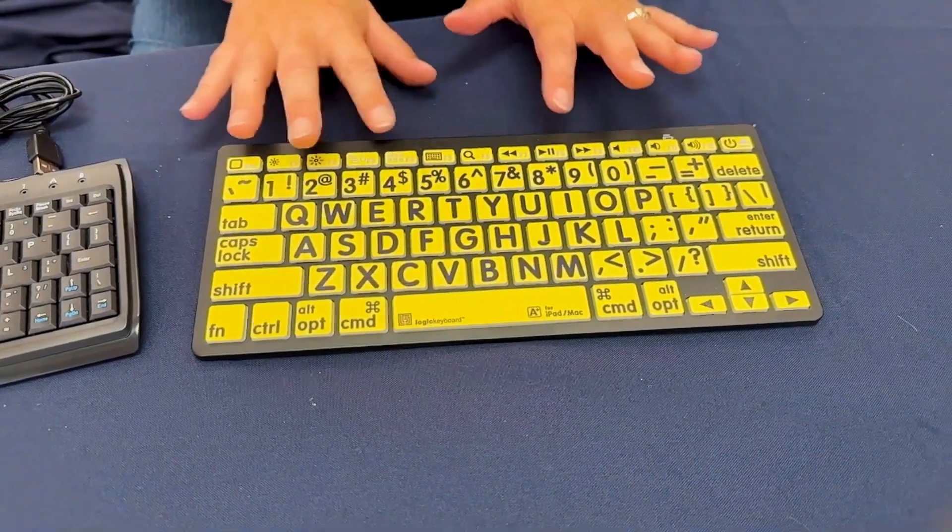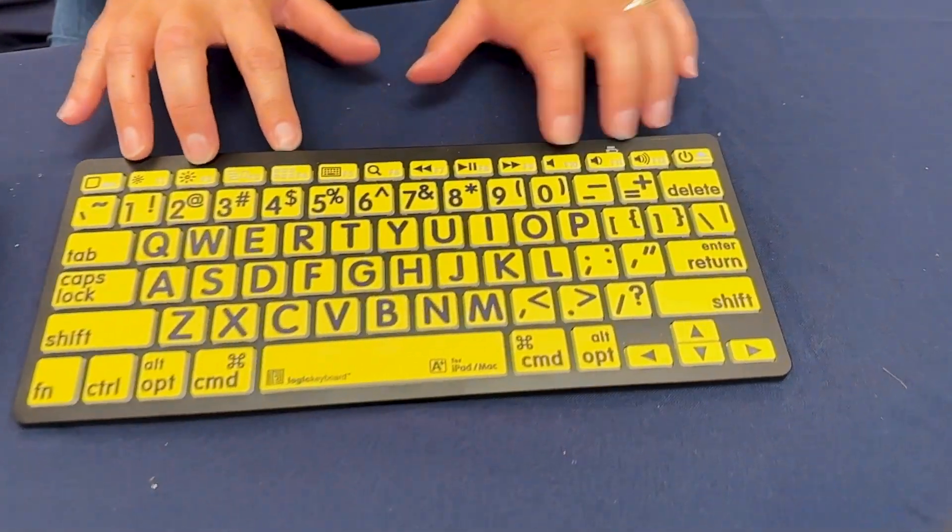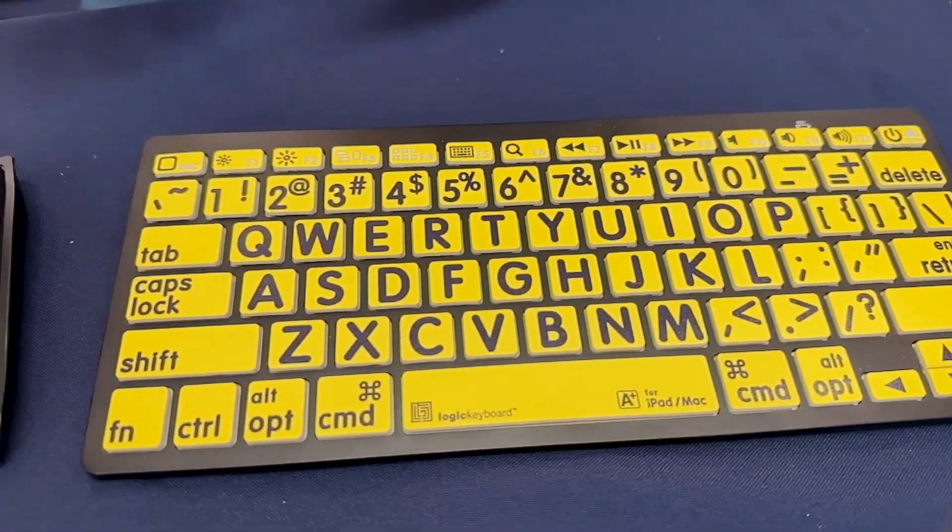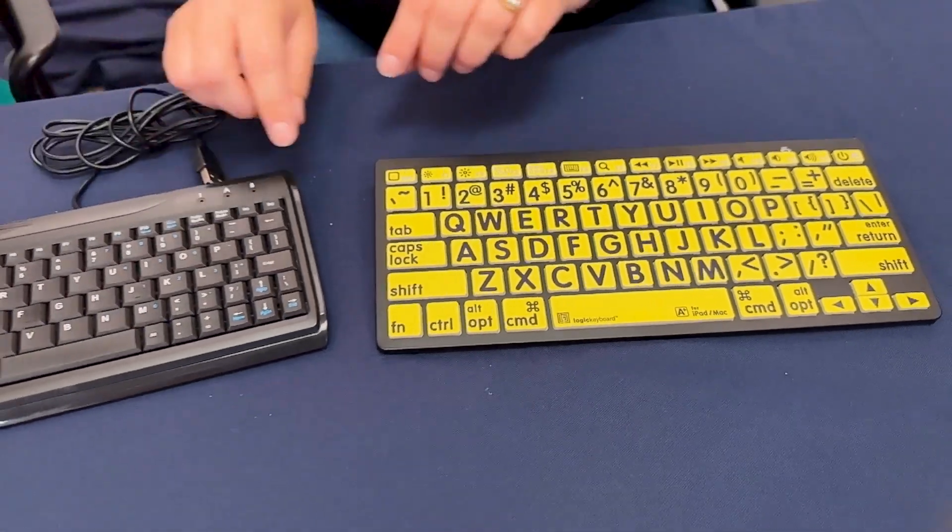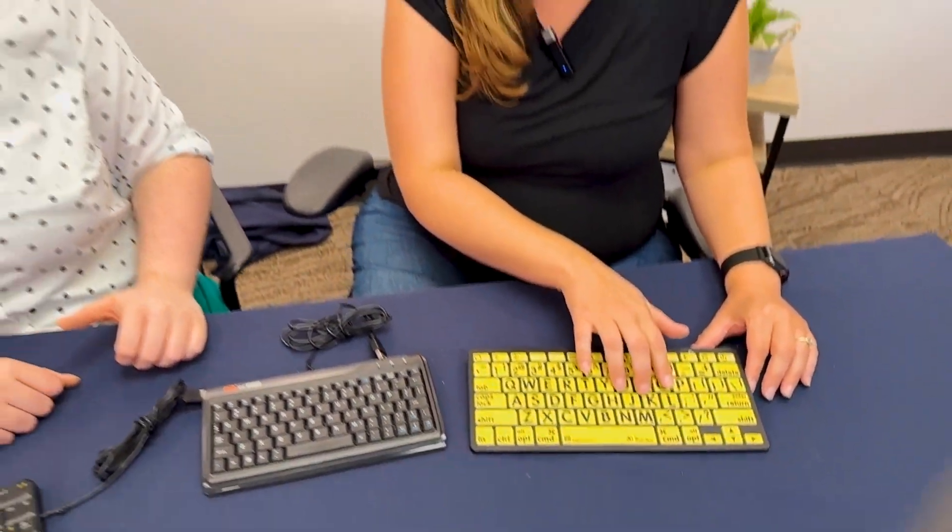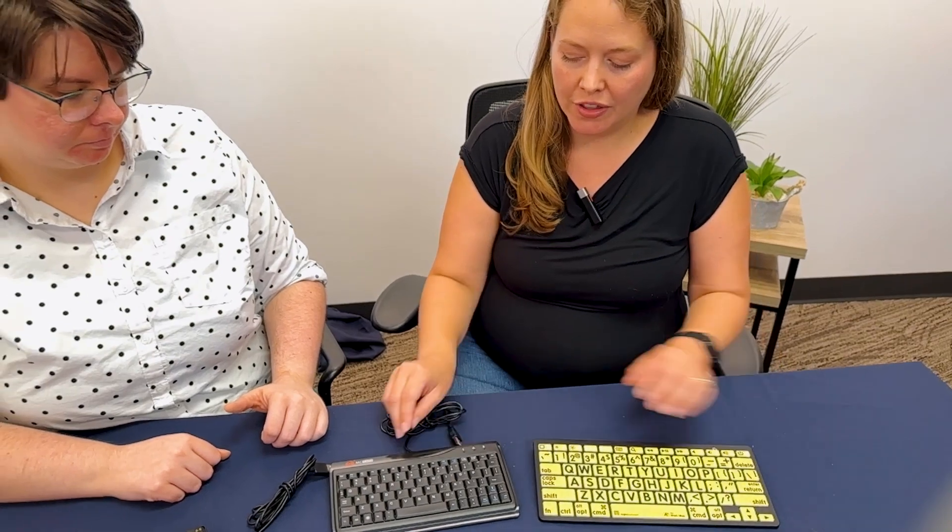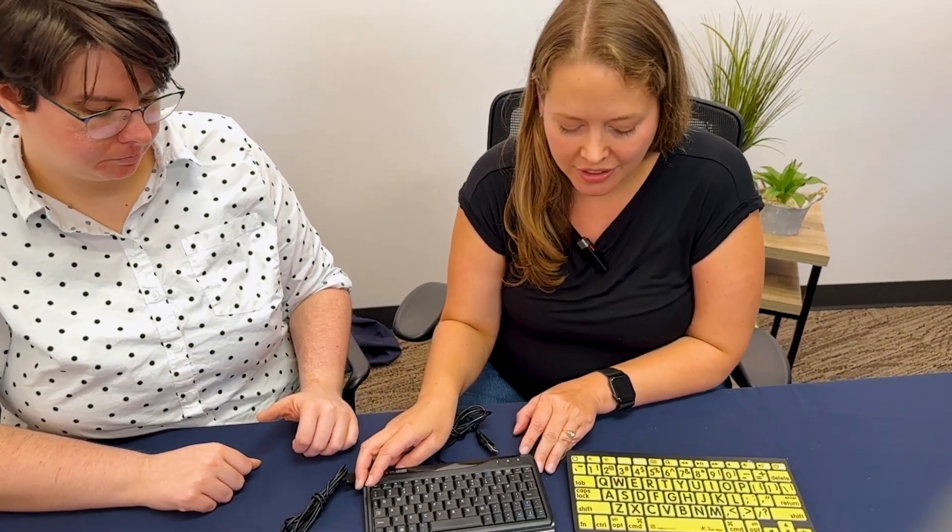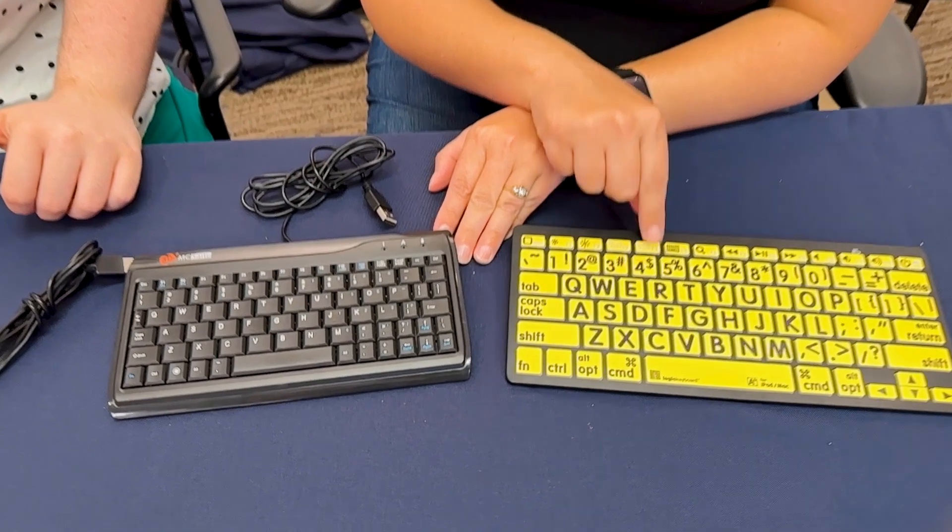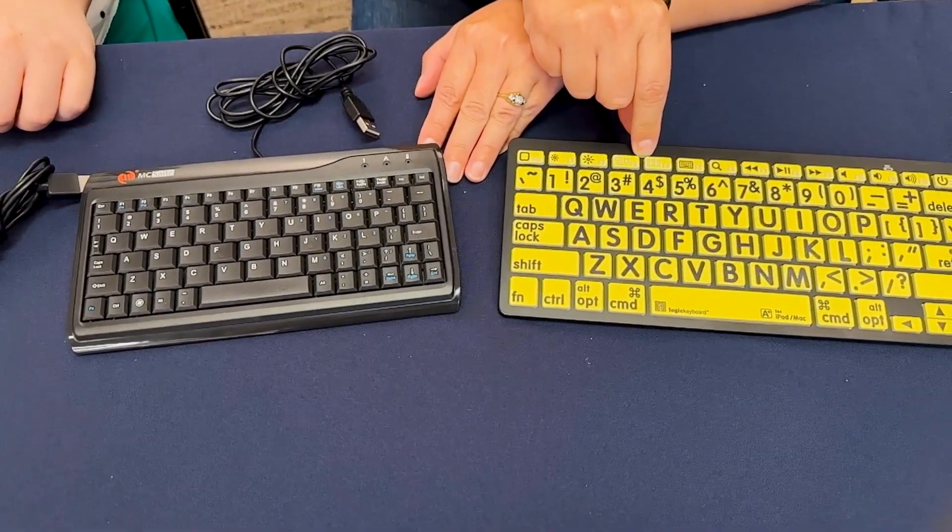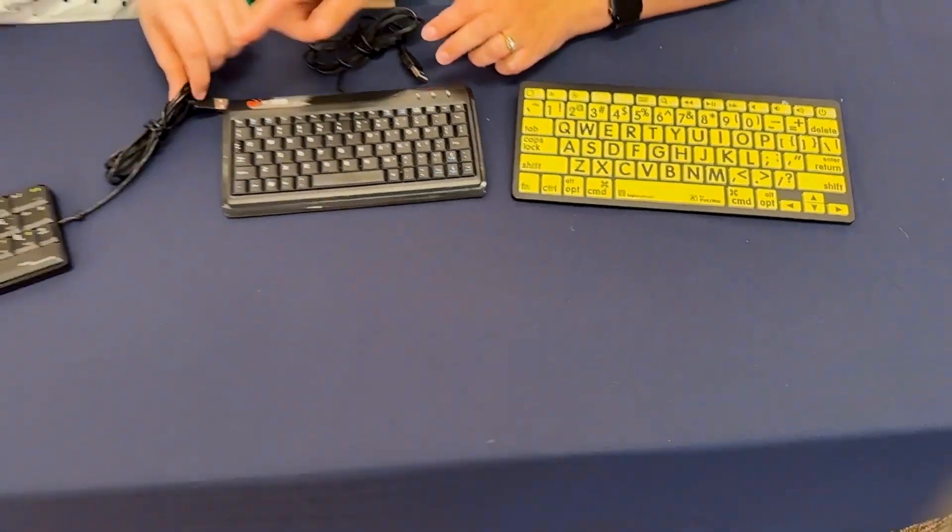It just depends on the person's needs, how large their hands are, their placement, how their vision is. If you compare the letters on this keyboard with the first one that E showed, it's a whole lot easier to see these keys. And then E has one more special keyboard.